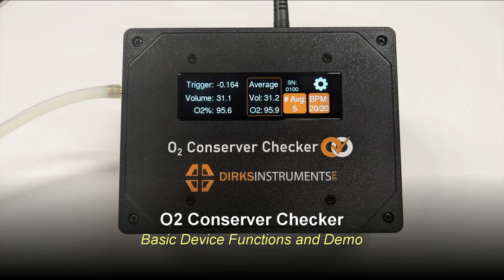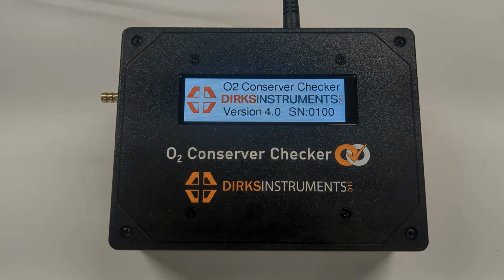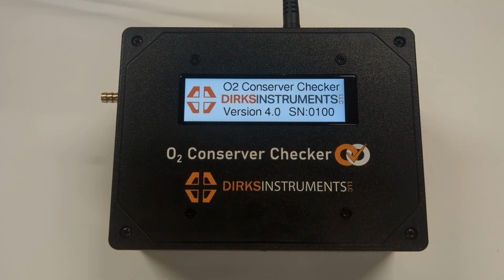Hello, in this video we will go over the basic functions and settings of the O2 Conserver Checker. When you first start the device, if it has the oxygen concentration option, it will go through a 20-second purge of the oxygen sensor, followed by a brief zeroing process.